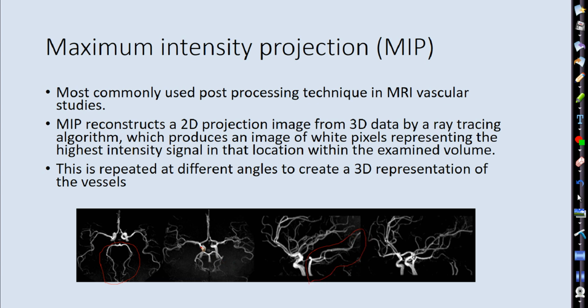Okay, it's harder from the coronal because they're kind of overlapping each other. But that's a good way to get you started. And then you spin them, and then you nod them for the radiologist. So you give them different rotations so that the radiologist can really see if there's any type of stenosis or occlusion.